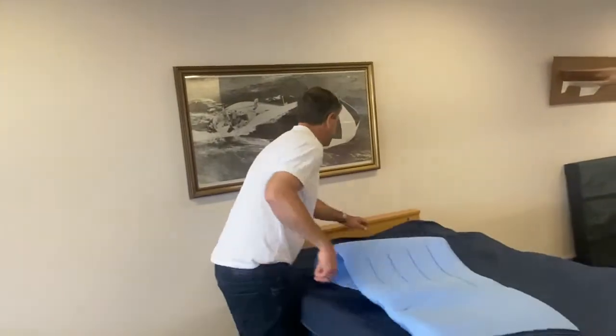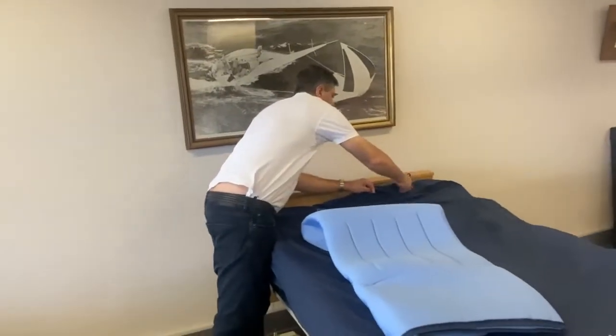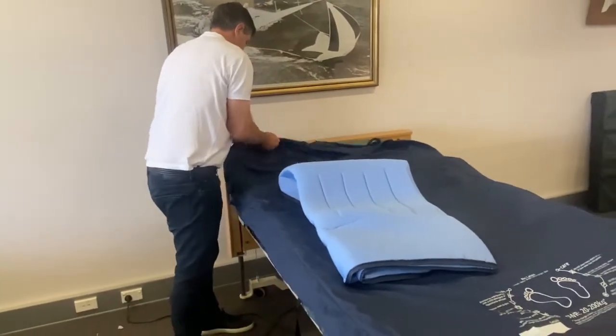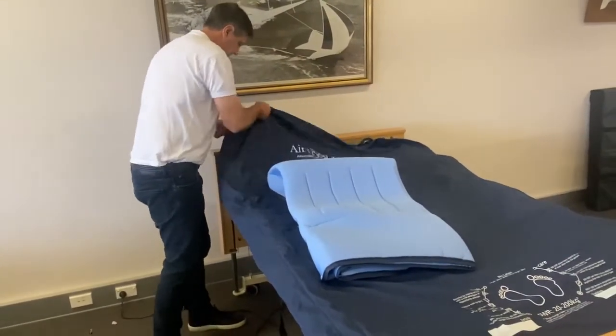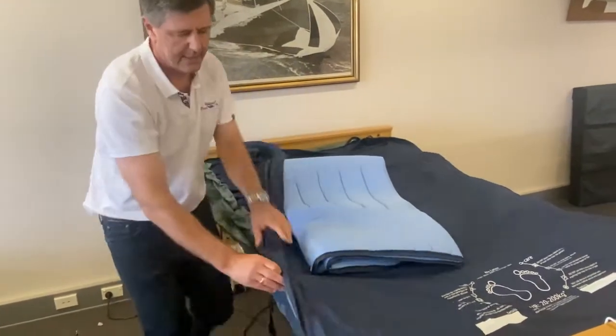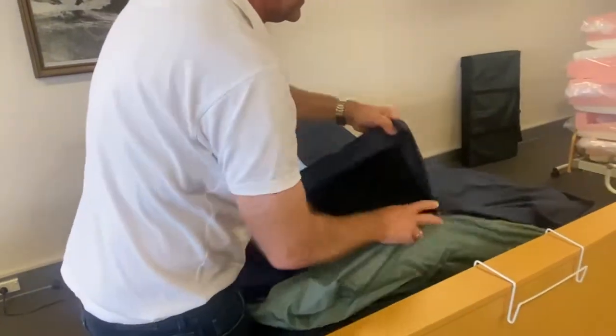So essentially our first thing to do is to remove the top cover completely. So make sure the mattress is fully deflated. So the top cover should come off fairly easily.